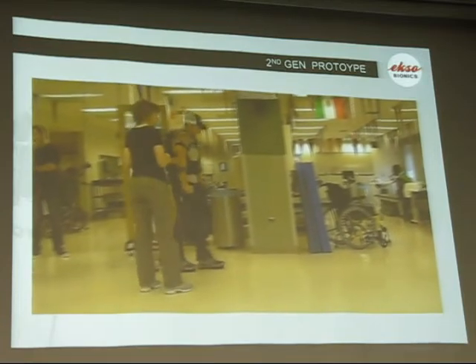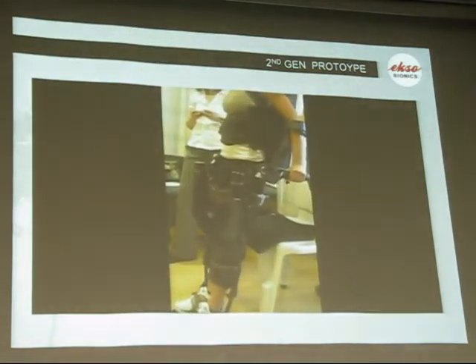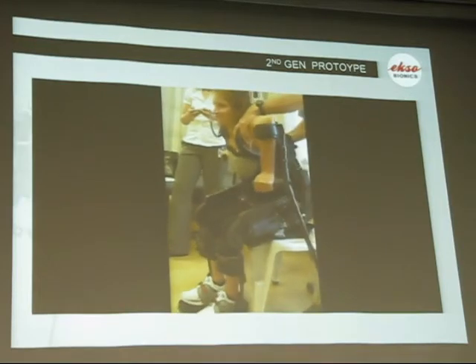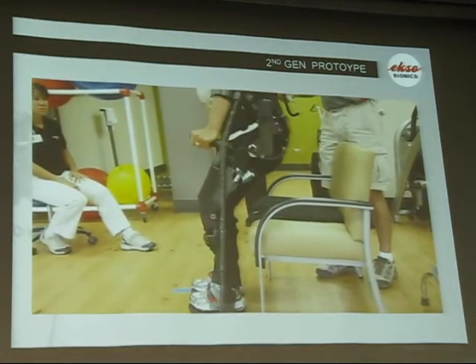These are various rehab centers testing the product. How do you prevent overextension, like accidentally having the user end up in a split or something dangerous? We have hard stops, and we've tried to size the Exo, both the Hulk and the Exo, so that its range of motion is constrained to the human range of motion. In the case of the Hulk, we can prevent rolling an ankle, twisting a knee, or hurting a hip. It has a neat design where in flexion it runs out of range of motion, so it can't fold you backwards if you had a catastrophic runaway. The other way, due to the geometry of the linkage, it runs out of torque, so it can't fold you in half.